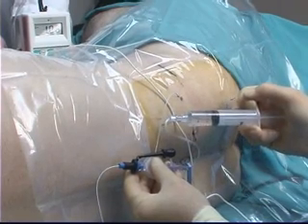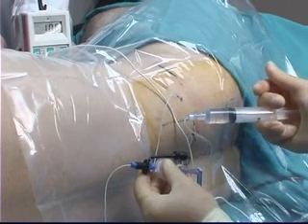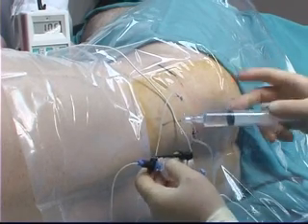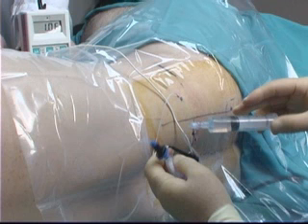inject local anesthetic agent or, as in this demonstration, normal saline through the catheter. Notice that the motor response stops immediately upon injection of the normal saline. This constitutes a positive Raj test, which gives final assurance that the primary and secondary block will be successful.